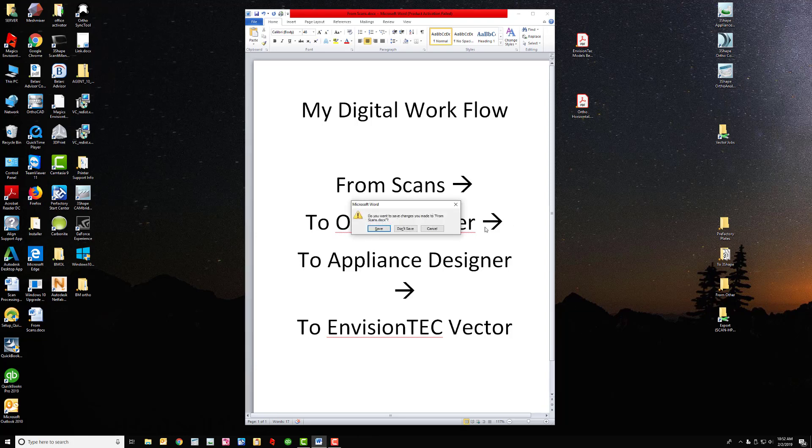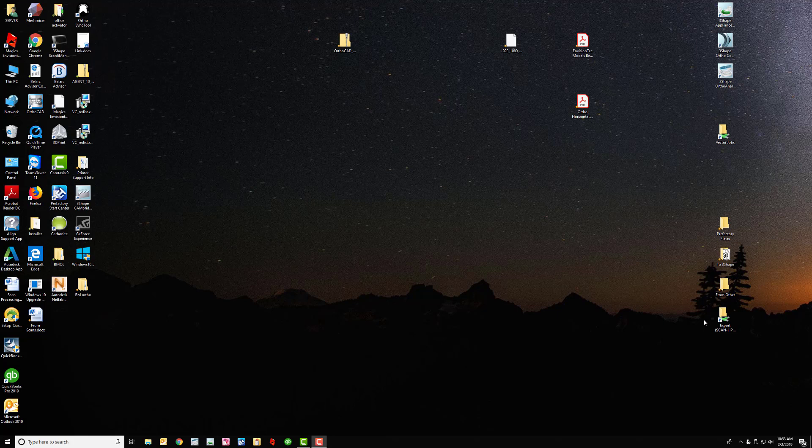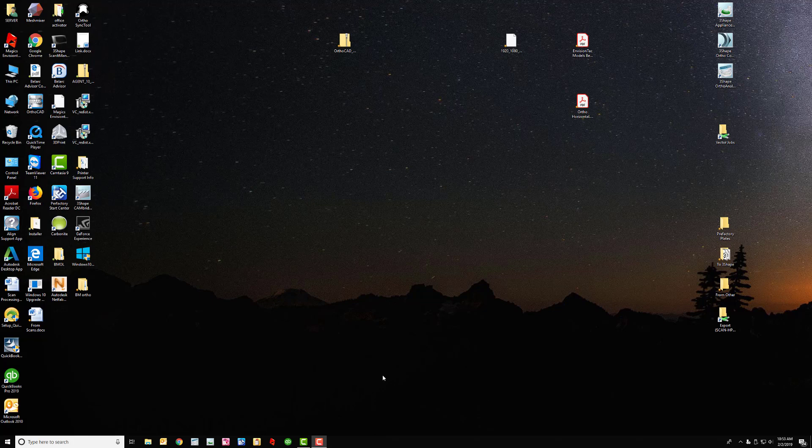It really starts off with this here. I have a file folder that I put scans into, a file folder going to 3Shape, and of course the prefactory plates and the vector jobs and the export folder, which all comes into play trying to maximize my workflow time.